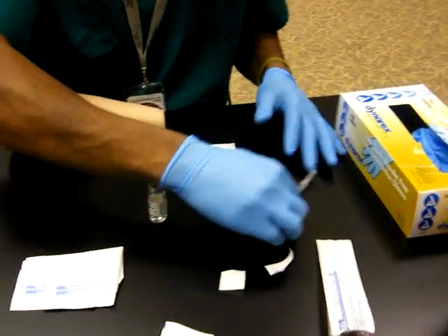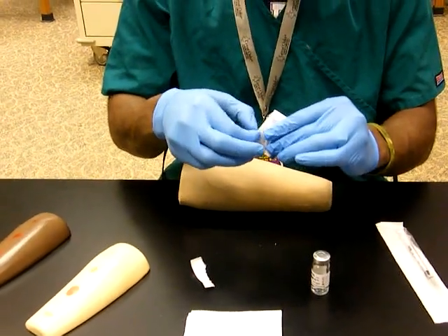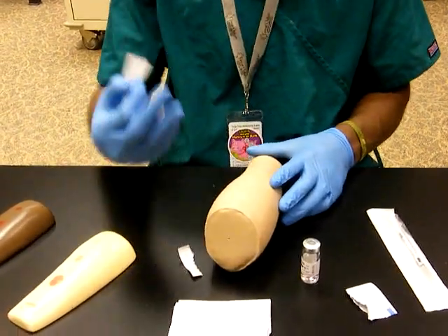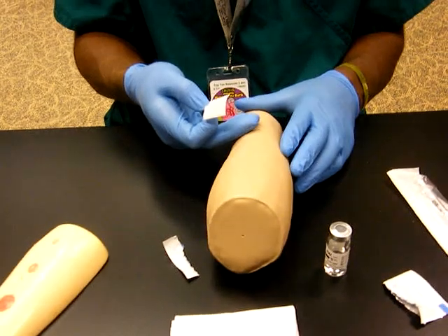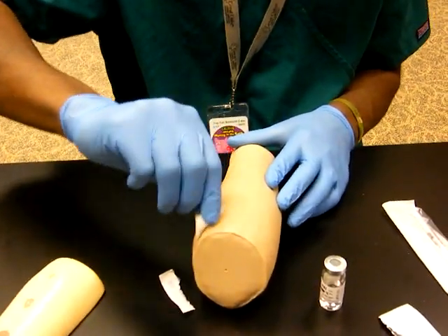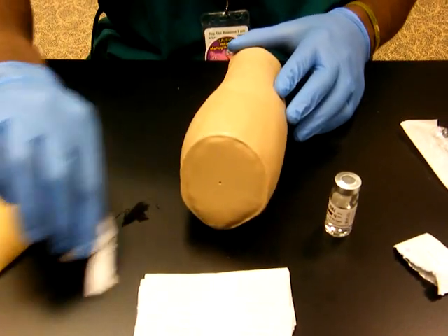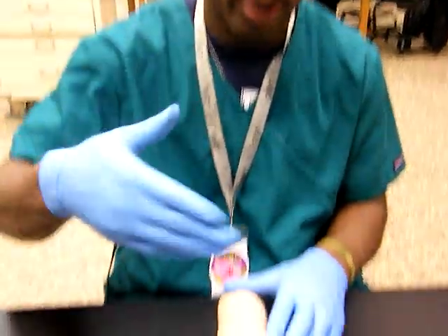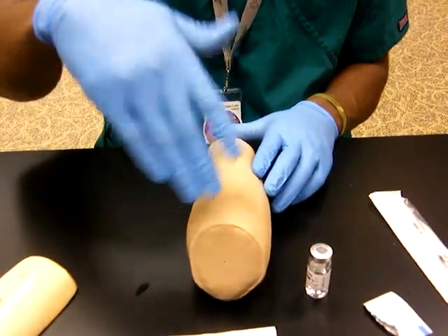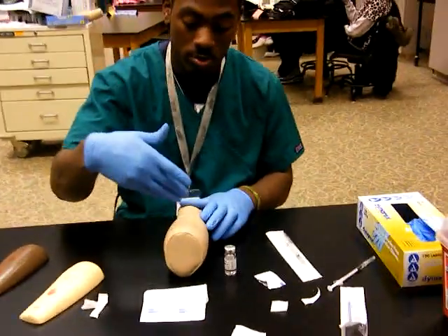Put the needle back in the cap. Grab another alcohol pad and wipe off the patient's arm. When you're doing this, you want to make sure it's the thick part of the arm and not the bony part, because if you do the bony part of the arm it would hurt the patient more. You want to wipe it off, clean the area, sterilize it. You want to make sure that it is not blown dry from your air — you want to make sure that it is air-dried naturally, because if you blow dry from your mouth it contaminates it. It blows more germs from your mouth; your mouth has the most germs over your whole body.